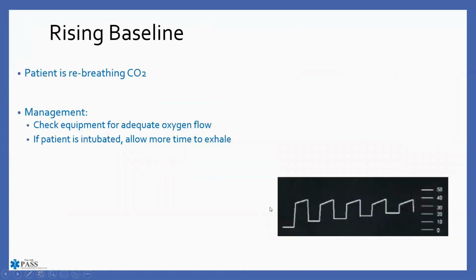All right, a rising baseline. So what they're looking at here is your, I wanted to say isoelectric line, your respiratory baseline, but you can see that baseline is starting to go up. It is no longer coming all the way back down. This is that situation where you're making the patient hypercarbic, or the patient is making themselves hypercarbic. The patient is rebreathing their CO2. This can be bad long term. You don't want to do this.